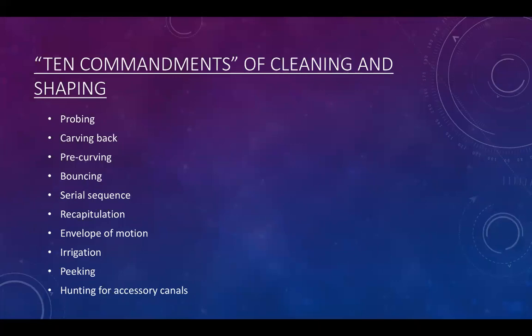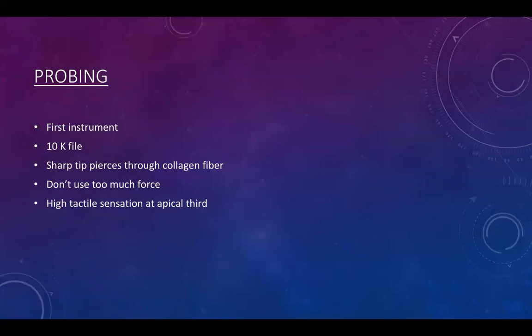There are 10 commandments of cleaning and shaping. Each one of these, we tend to try to follow as much as possible. Following them based on their correct technique is the ideal. I know it cannot always happen, but our goal is to be as close as possible to these techniques in order to increase the chance of endodontic treatment success as high as possible.